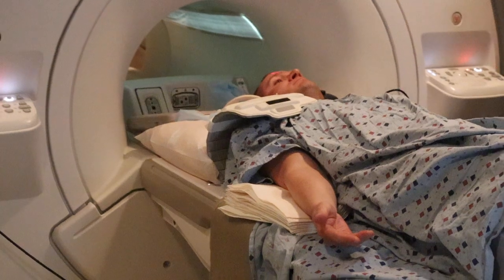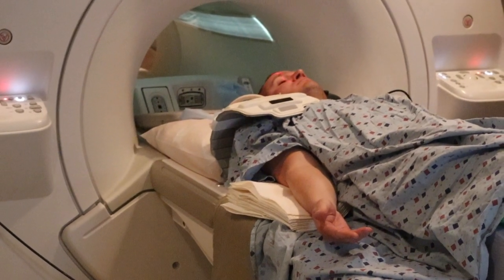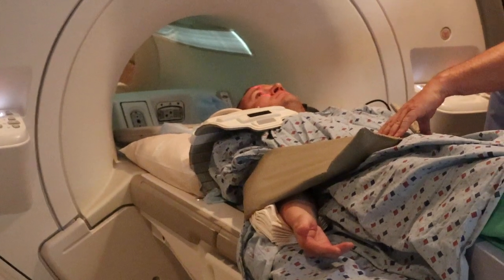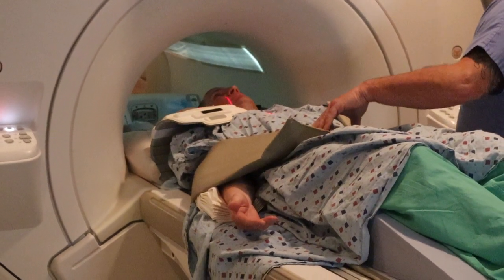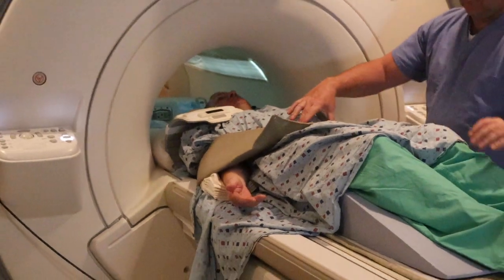You're going to advance the patient in, making sure that they're not touching the side of the unit. Landmark, and advance the scan.